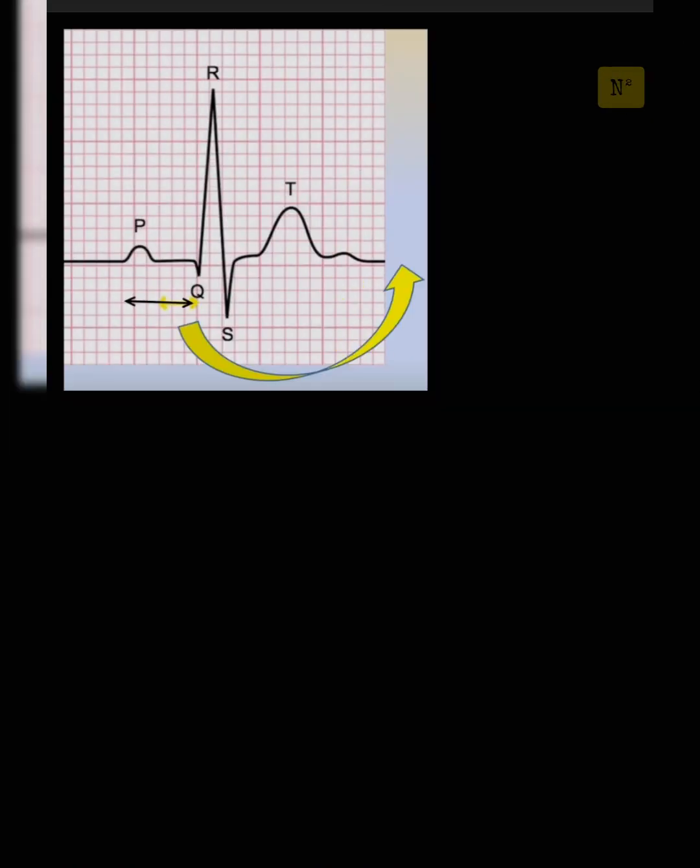Now apart from the waves or curves that we get in an ECG rhythm, there is a PQRS complex and T waves and U waves. You also get some segments and intervals. Segments are, if you're connecting two dots by a straight line, that is called a segment.